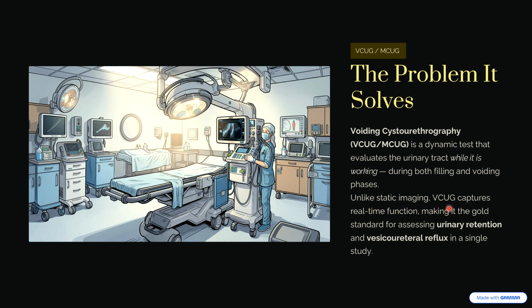Unlike static imaging, VCUG captures real-time function, making it the gold standard for assessing urinary retention and vesicoureteral reflux in a single study. So, when the urinary bladder is not under function, then it gives a static image. But in case of VCUG, or voiding cystourethrography, we can see the movement of the urinary bladder and how it evacuates, how it is filling, how it is voiding. Everything is totally visible, which gives us a more clear picture.